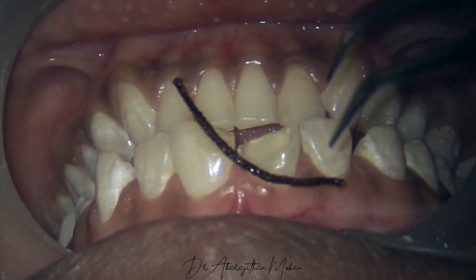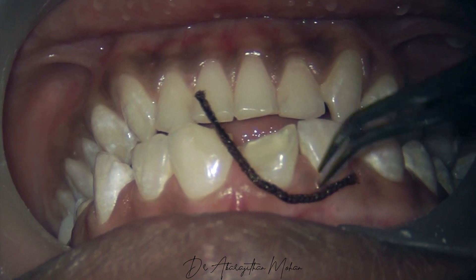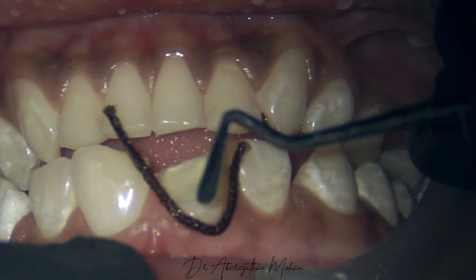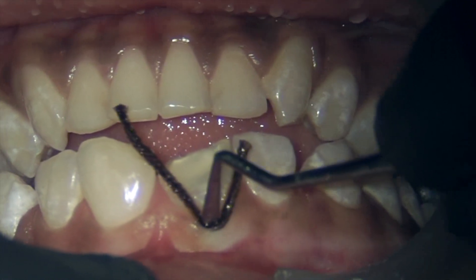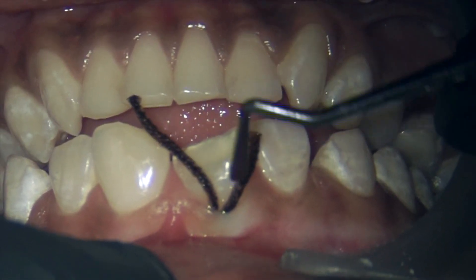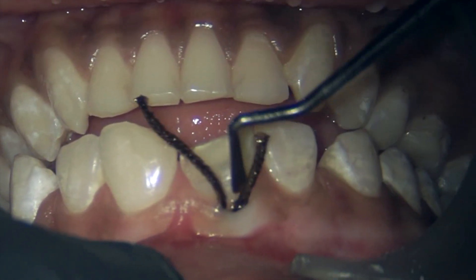This is another very important step to protect the gingiva and the periodontium. I'm just placing it around the neck of the tooth. Since it's just a veneer preparation, I will not have to do a 360-degree retraction cord placement — I'm just going to place it mainly on the labial and the interproximal area.